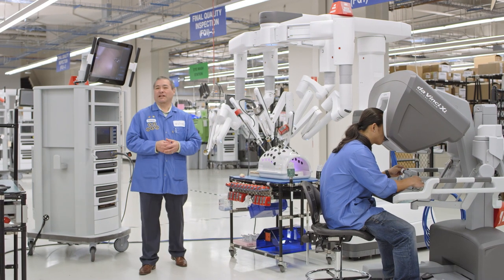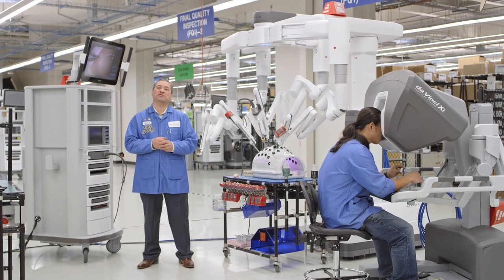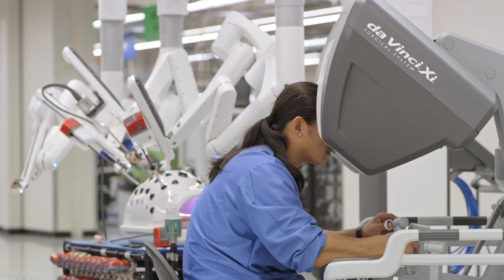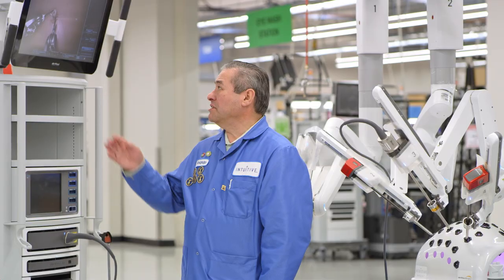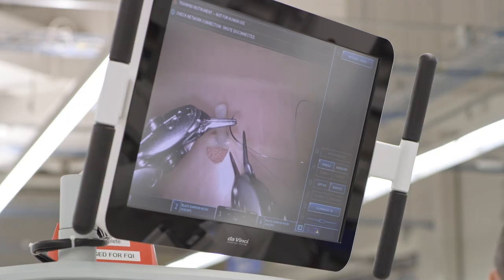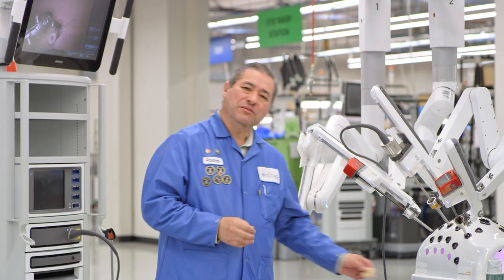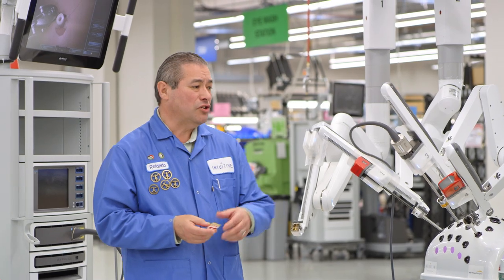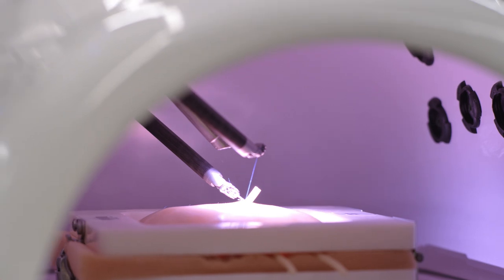This is our final quality inspection area, where test technicians will perform three surgical procedures on simulated models. This is Chen Li. He is testing the dexterity and the command of the system, making sure that it is articulating in the correct manner, ensuring that it'll work for the doctor in a surgical setting. This is a simulation of a gastric bypass that Chen completed yesterday, and he's currently working on a simulation of a TECAB procedure, or a total endoscopic coronary bypass.